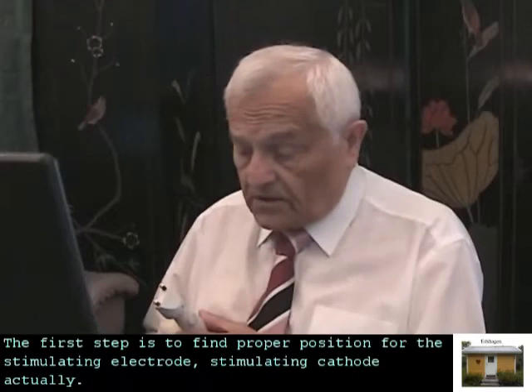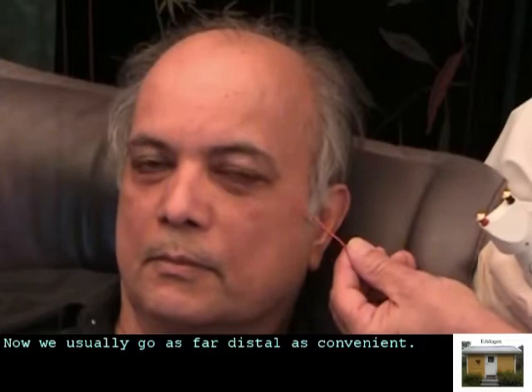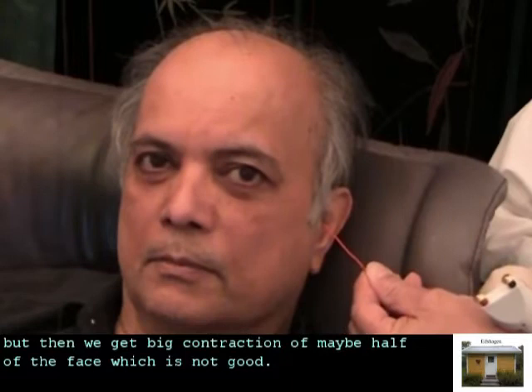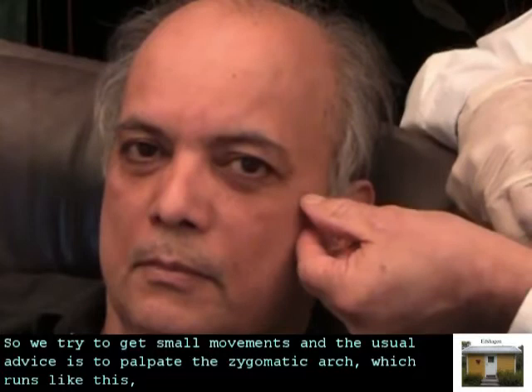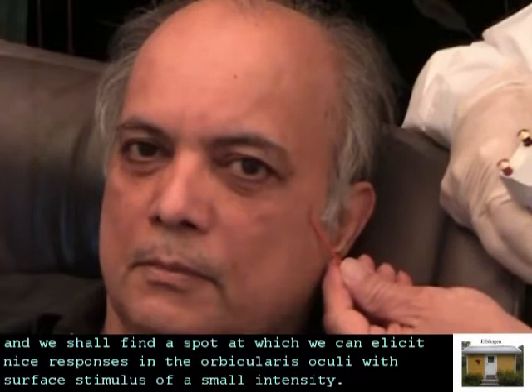The first step is to find the proper position for the stimulating electrode — the stimulating cathode. We usually go as far distal as convenient. We could start stimulating where the facial nerve emerges, but then we get a big contraction of maybe half of the face, which is not good. So we try to get small movements. The usual advice is to palpate the zygomatic arch and find a spot at which we can elicit nice responses in the orbicularis oculi with a surface stimulus of small intensity.